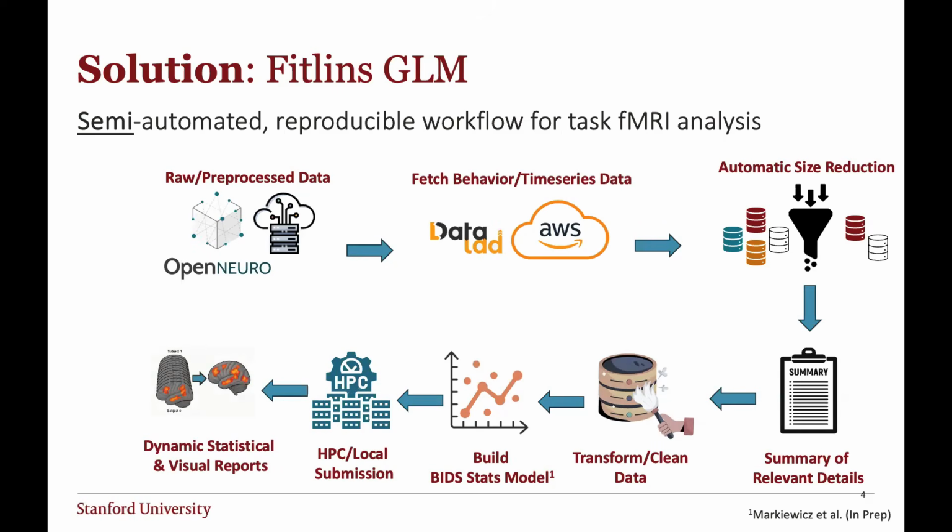And then finally, once everything runs, depending on the group model, we want to also facilitate the reporting, with automated dynamic reporting styles that ingest all the program readable files. Because there are already structured ways of reporting, like the COBIDAS checklist that was created from OHBM, Tom Nichols and others, we want to facilitate the reporting so it's consistent, coherent, and not as variable as it currently is in the literature, because it's often hard to understand what models people fit.